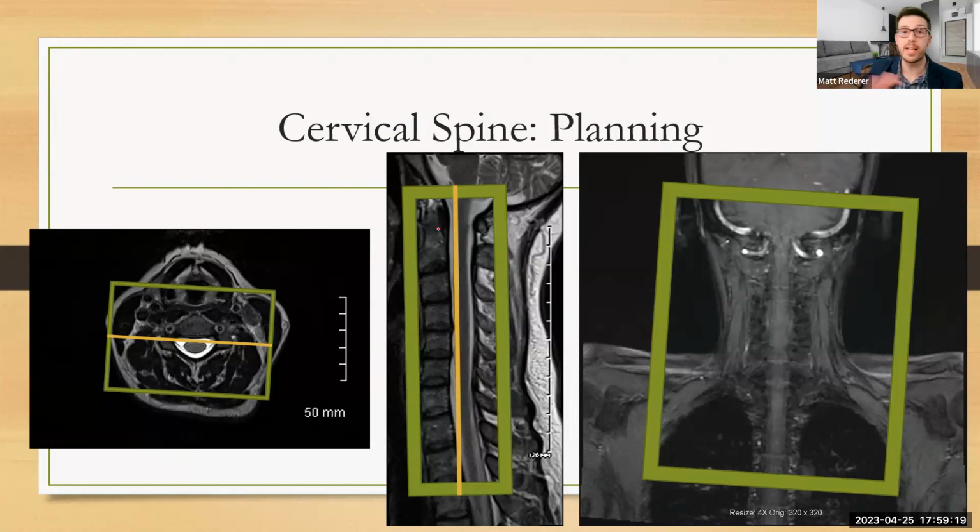I don't care about anything else besides the cervical spine when I'm imaging the cervical spine. And if a patient has scoliosis, their coronal image, the spine would look something like this. Now, this is extreme scoliosis, but I've seen pretty extreme before. So it does look sometimes wild.